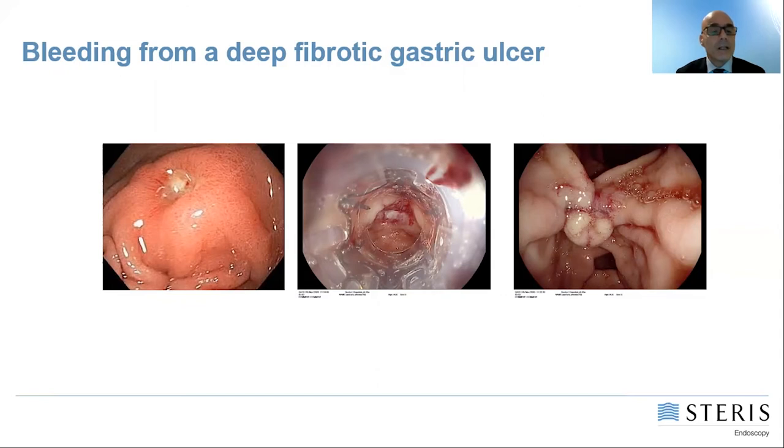This is a fibrotic ulcer which has been easily treated by the application of a padlock clip. We were able to suction the tissue without any problem into the cap chamber, without needing any other device to pull the tissue inside.